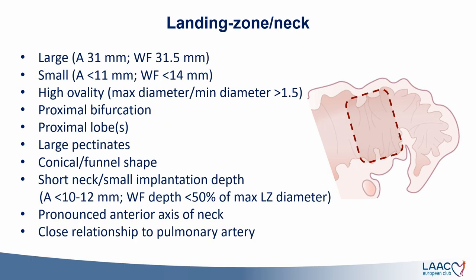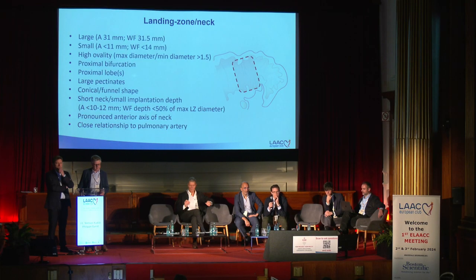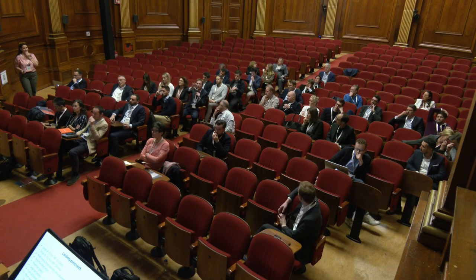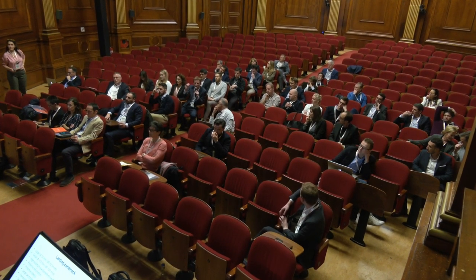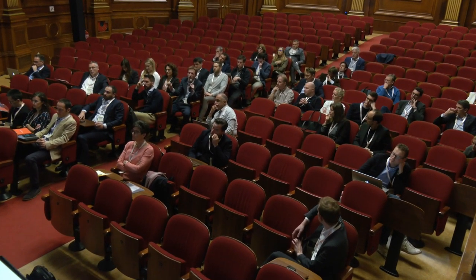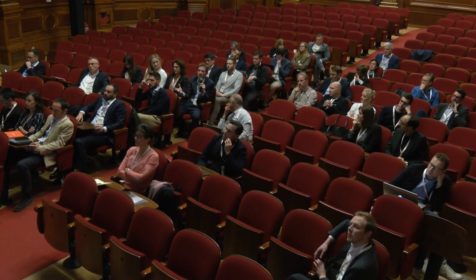And Sirik, maybe back to that slide also. I think a short neck and a short implantation depth are two different things. With a short neck, I think what you mean is probably a real chicken wing. So you almost don't have a landing zone. You have something that goes into the appendage and immediately you have a sharp turn. That stays difficult with any device.